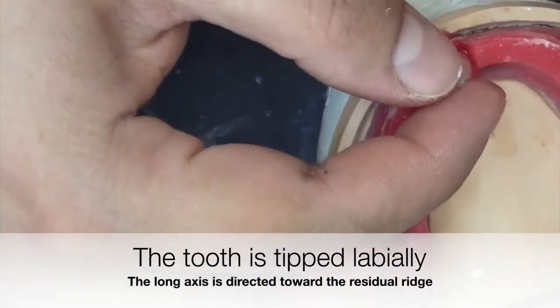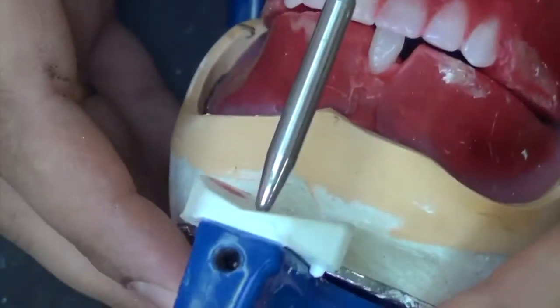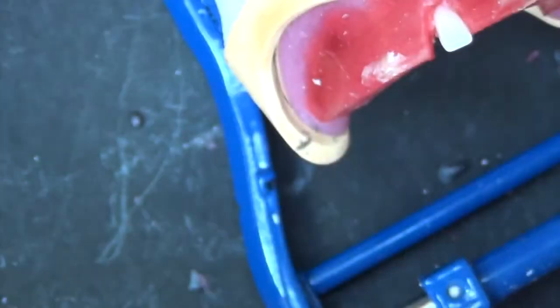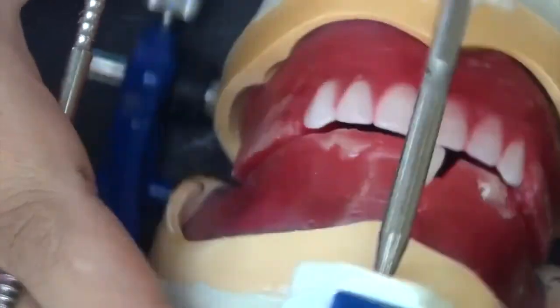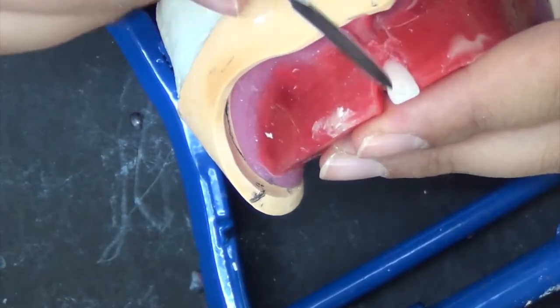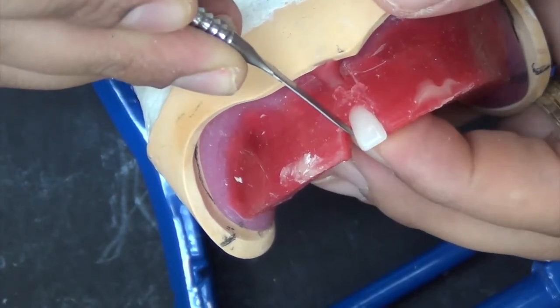The tooth is slightly tipped labially, and the long axis is directed toward the residual ridge. Be certain that the neck of the tooth is depressed so that it is in form of the labial surface of the lower wax rim.